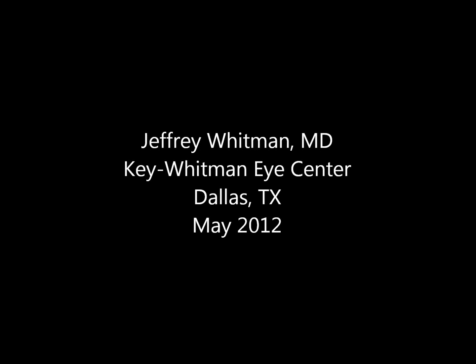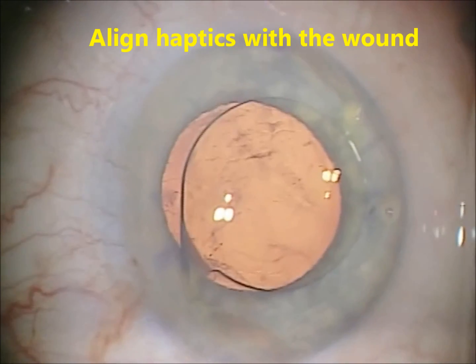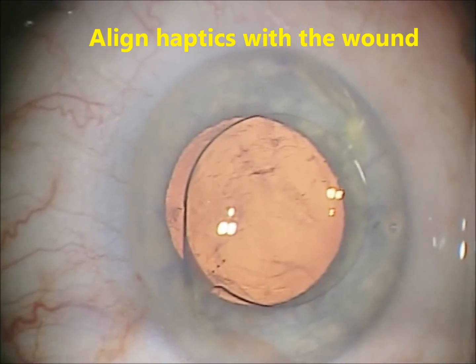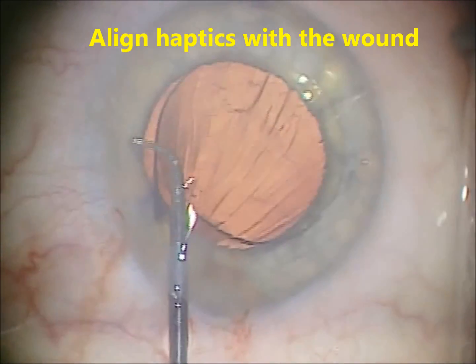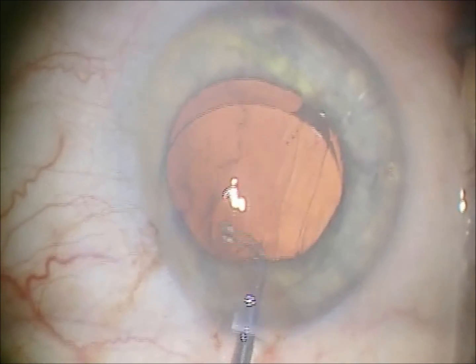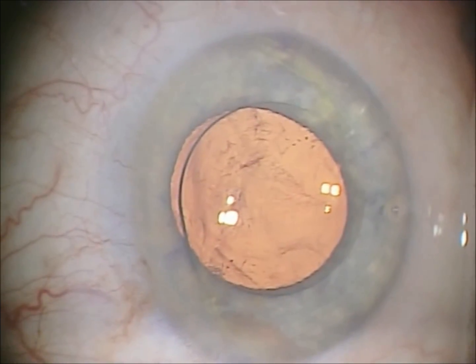The lens is moved into the anterior chamber after freeing up the haptics. You need to align the haptics to the wound, so you have one at the wound and one opposite the wound, which is in this case about 2.6 millimeters in width.